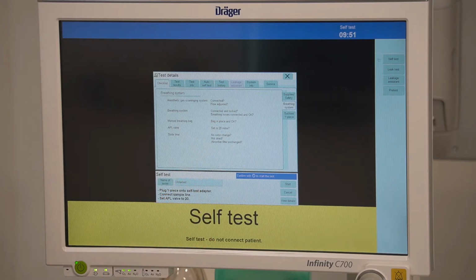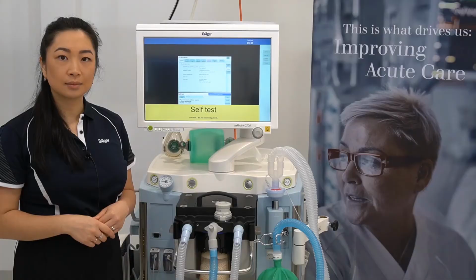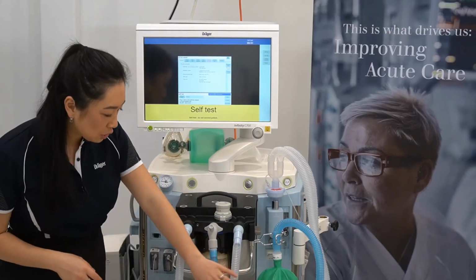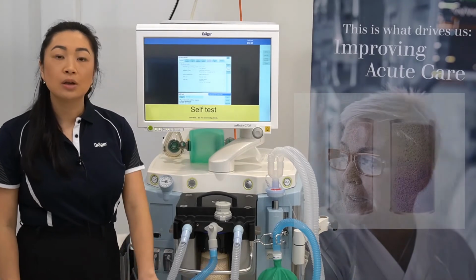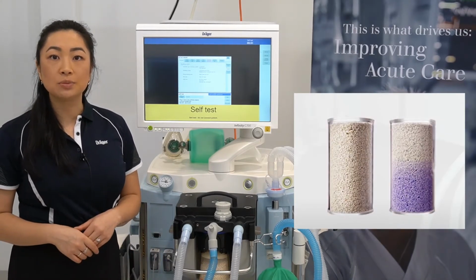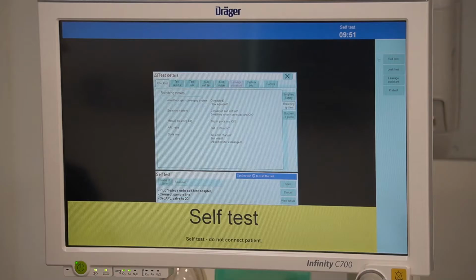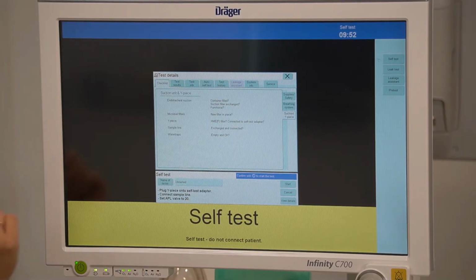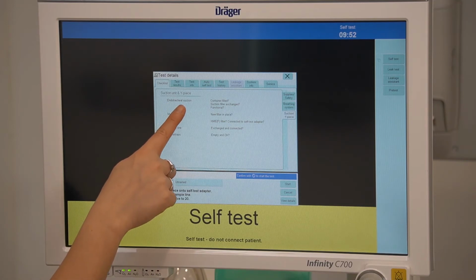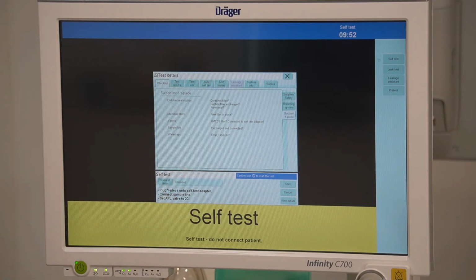Check that you've got your emergency breathing bag available. Ensure that you've got a manual resuscitator bag available in the event of device malfunction. To verify your oxygen flush is functional, this is done by holding down the oxygen flush button and observing for the filling of the breathing bag.